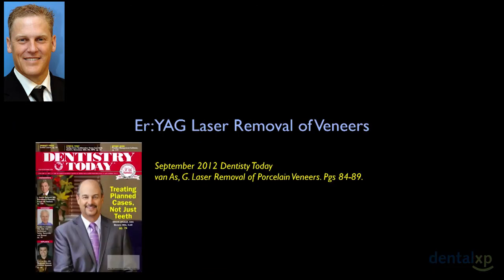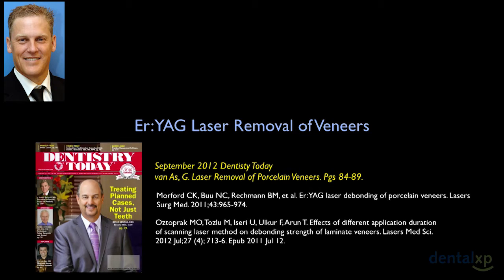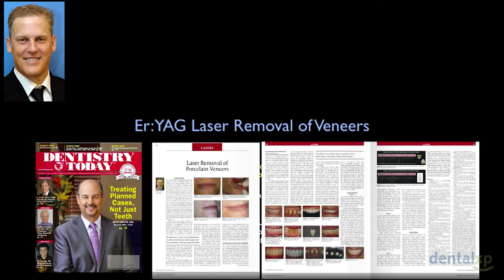I've written a number of articles on the role of erbium lasers in porcelain veneer removal. In fact, David asked me to come to Puerto Rico for the AAED and lecture on porcelain removal in under 60 seconds. I used the research from Morford and their group at UCSF and this Turkish group, which showed that laminate veneers could be removed with all tissue cutting lasers, erbium lasers.